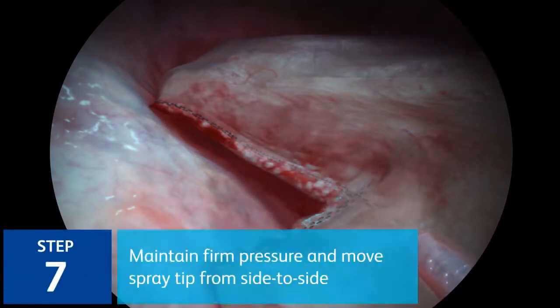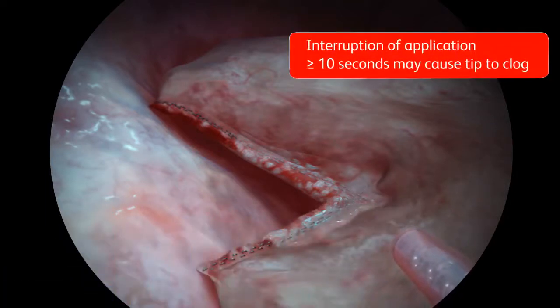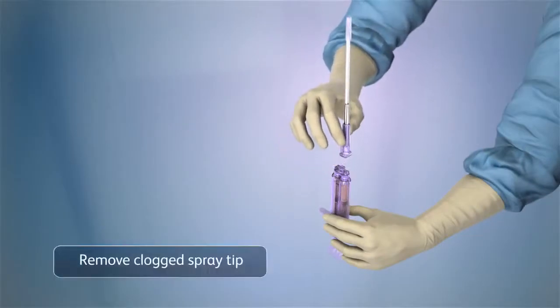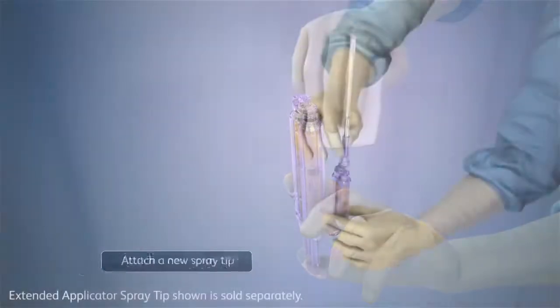Step 7. Maintain firm pressure on the push rod and move the spray tip from side to side along the margin of the tissue surface to be sealed during application. Interruption of application for approximately 10 seconds may result in occlusion of the spray tip. If occlusion occurs, remove the spray tip, wipe the end of the applicator to remove any fluid, and attach a new spray tip.